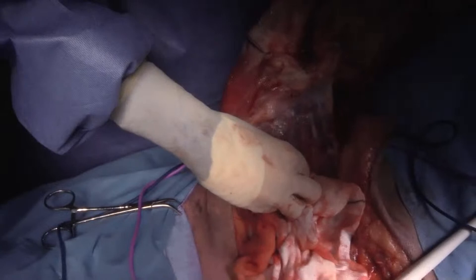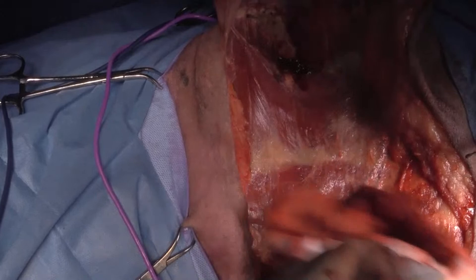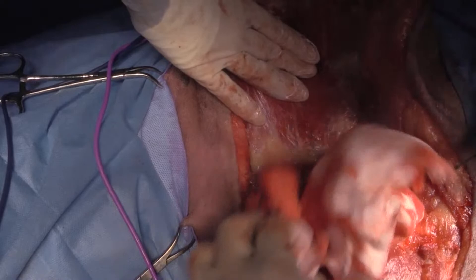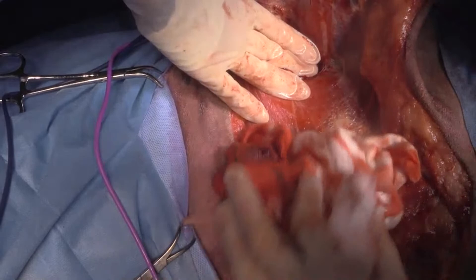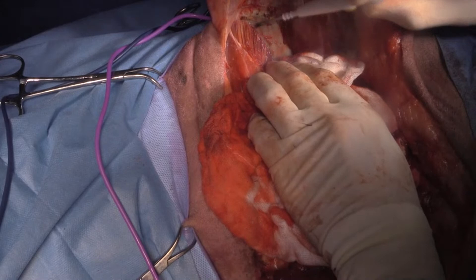So I'm just taking serratus ventralis off the medial aspect of the scapula. This is where we get the majority of bleeding, because the blood vessels actually retract into the bone.